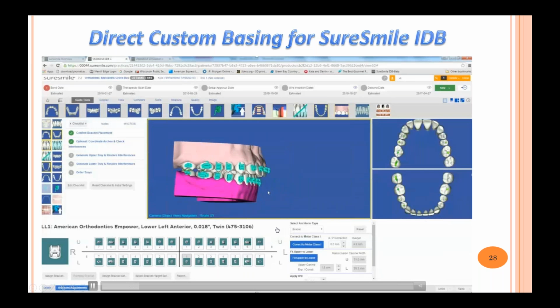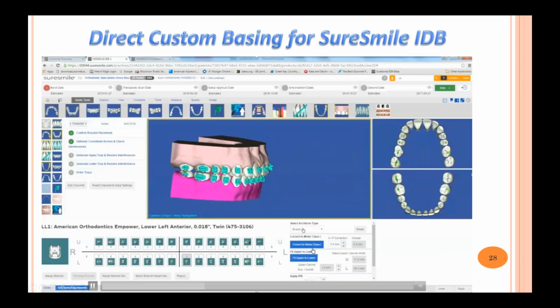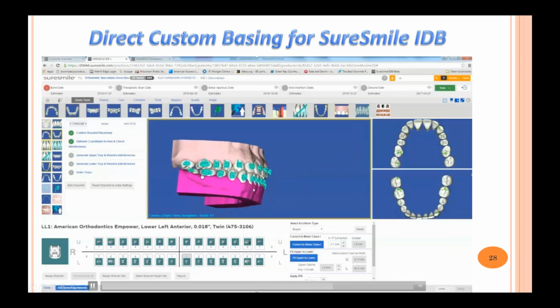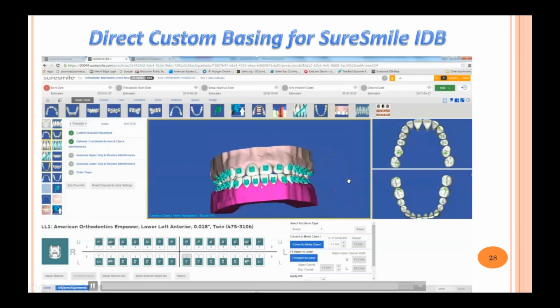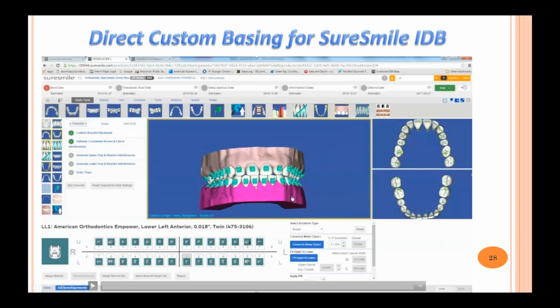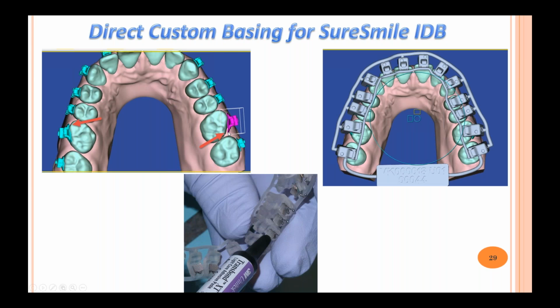And what this does is it's a class 1 simulation, very easy here. Watch me click on this molar class 1 box. It's pretty good. I think there are some improvements that can be made here, but look at what has happened. It's just a straight wire simulation, but it gives me a good idea of where that bracket needs to be, so that's what I did on the model that I showed you previously. And now let's look here, and this is where the bracket needs to be held.